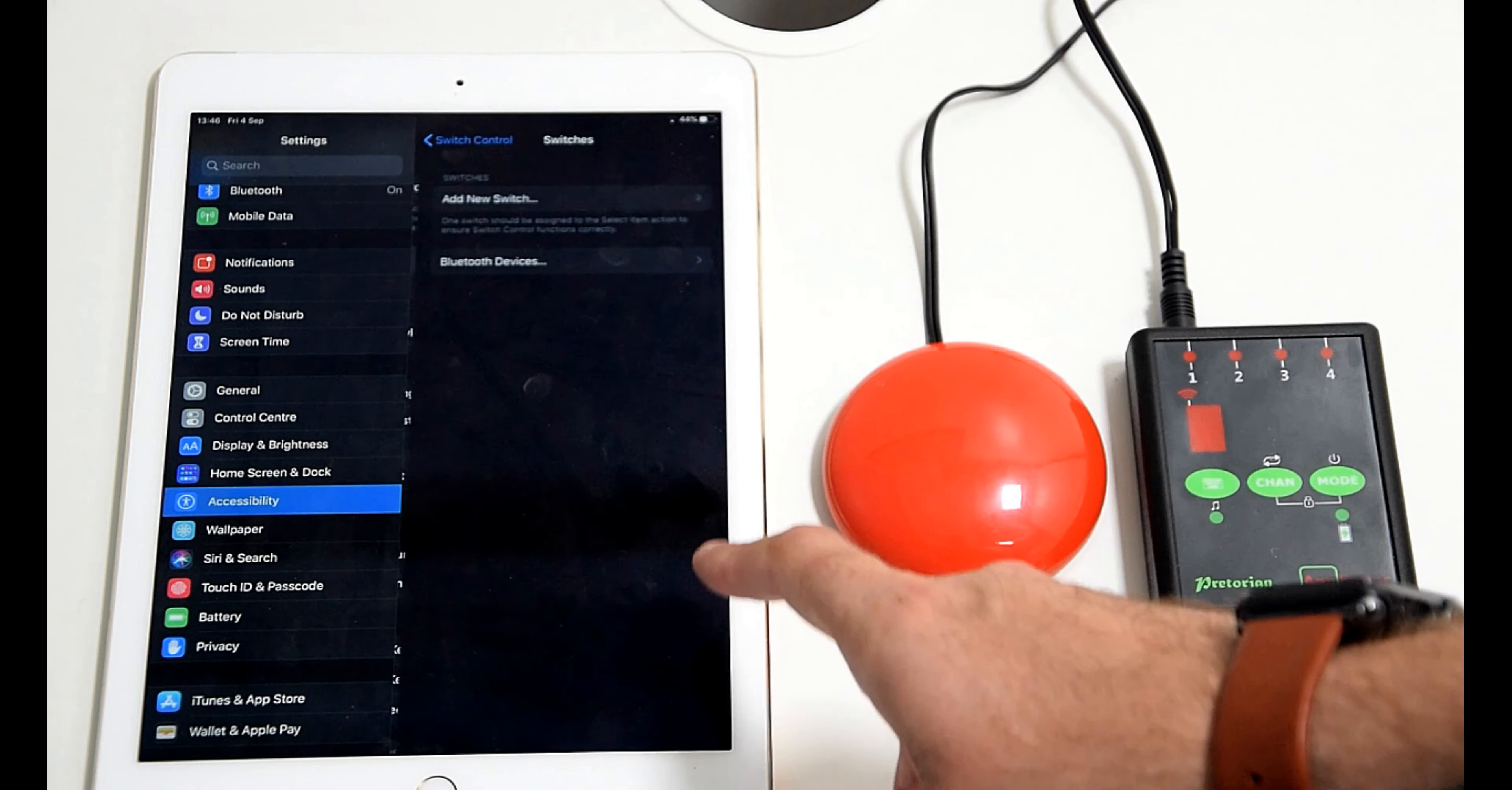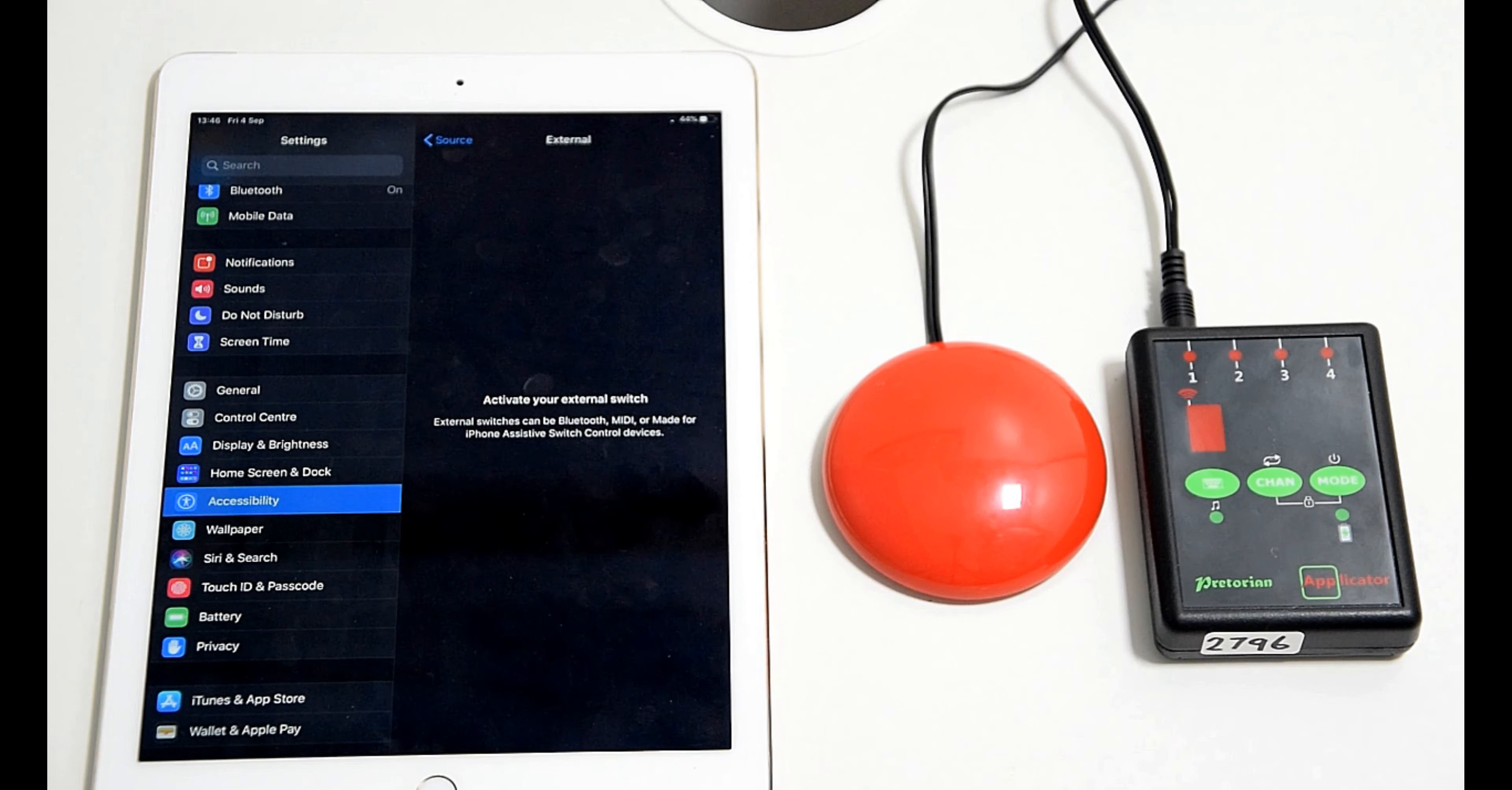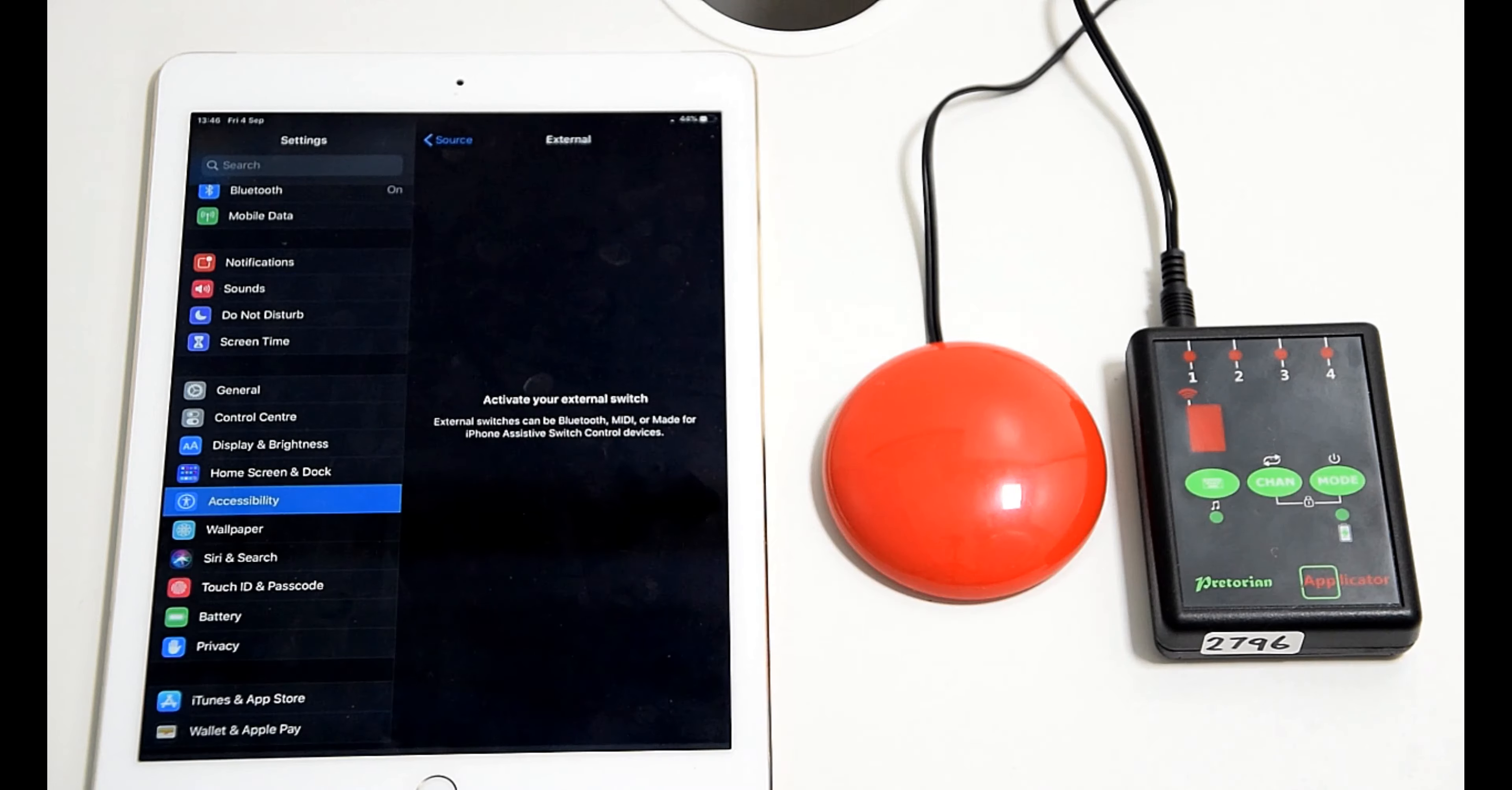So we'll go into switches and add new switch, external again and press the switch. We'll call it red again.